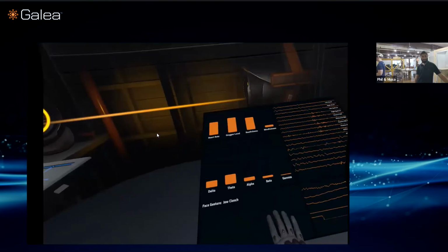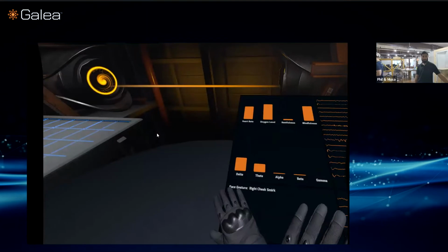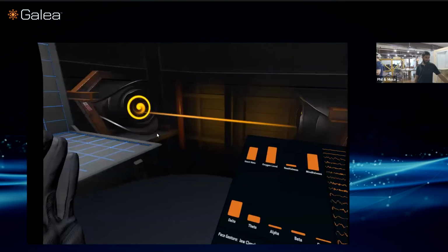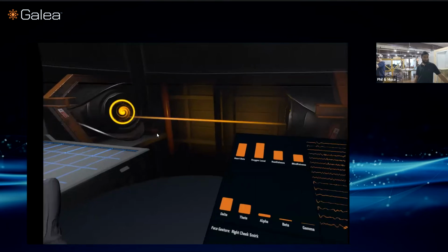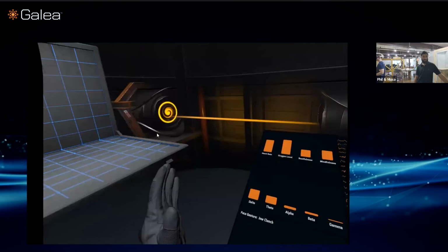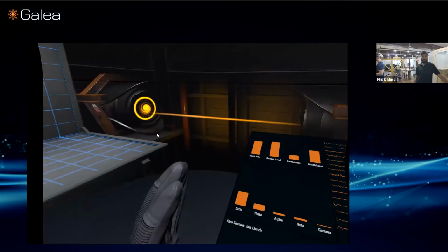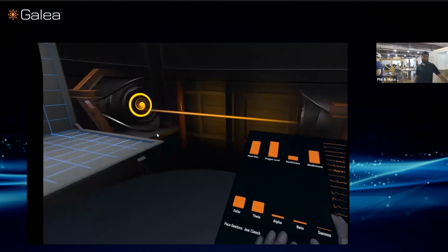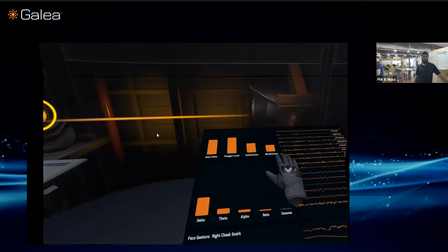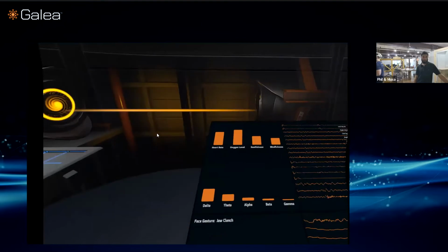And this is pretty similar to how we can use things like these band powers and these raw signals for EEG to try and listen in at different points on the brain, kind of like the dome in this analogy, and try and make educated guesses about what those different sounds, those different signals mean. And so a couple examples of this are these restfulness and mindfulness classifiers that we built here.